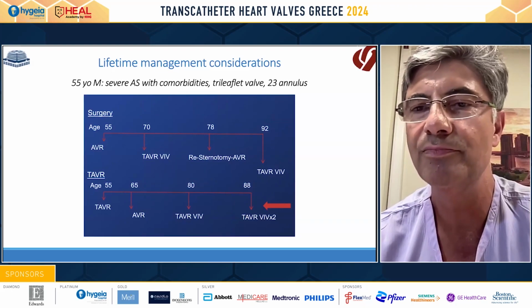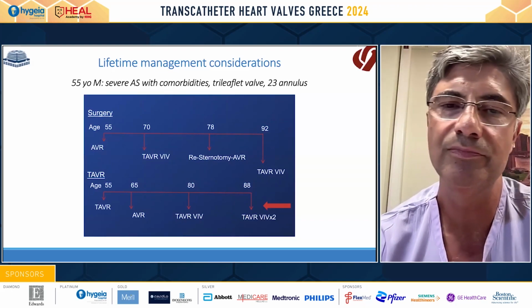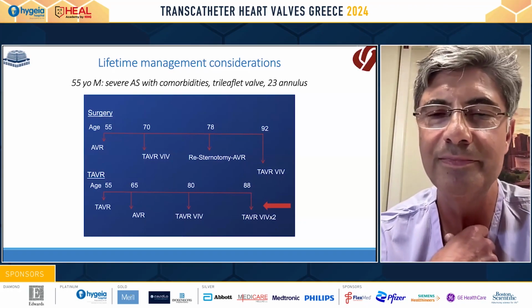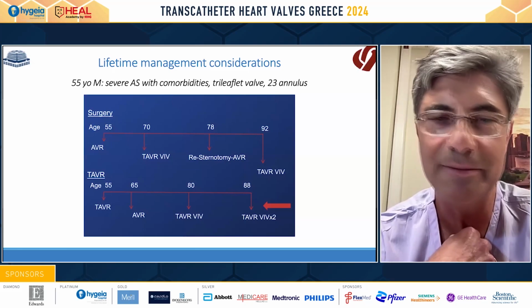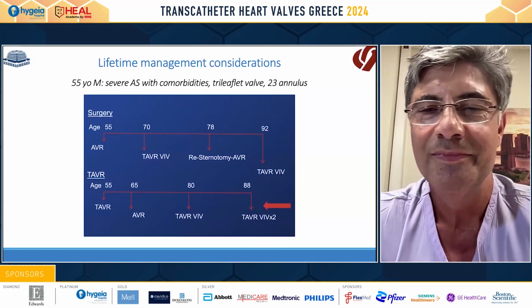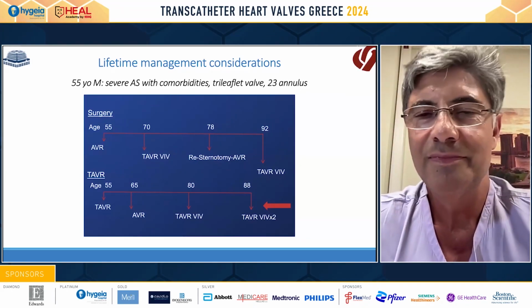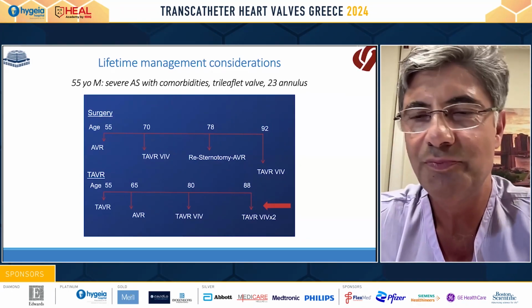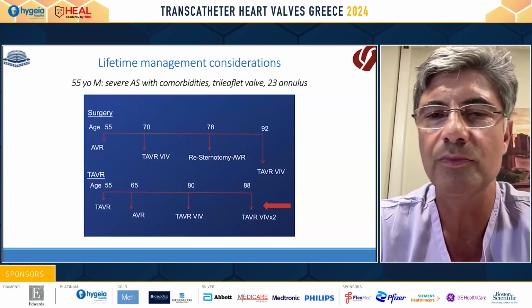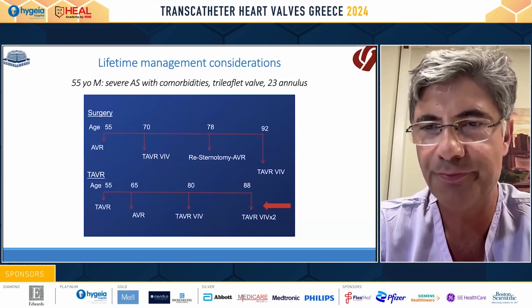You know, there are some rules that I have for my young faculty. One is I can do a redo chest, and I can do a radiated chest, but I don't do a redo radiated chest. This guy was radiated in 1986, back when they really used to burn you, and this guy's not going to live 20 years. He's going to be lucky to live 10 years. And STS in no way reflects what his actual risk is. Exactly.